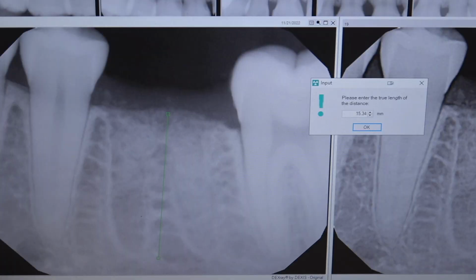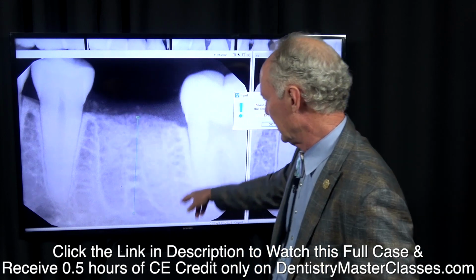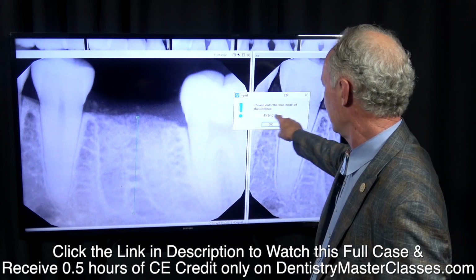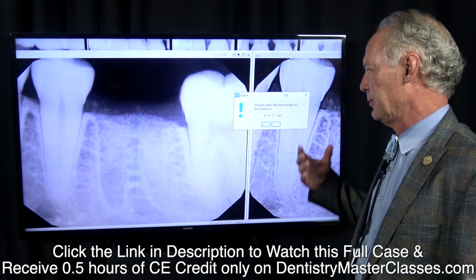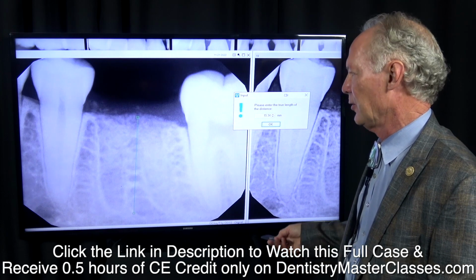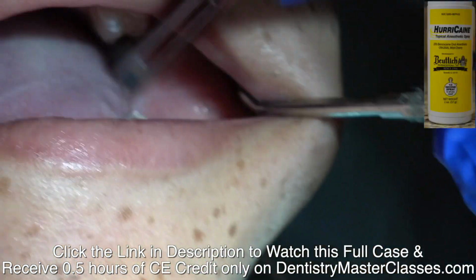So this is after 8 months of healing. It normally takes that bone about 6 months to heal, but you'll be able to see the outline of the roots even longer than that. So I know I've got 15 millimeters to the apex of the roots. So I'm going to place an implant that's 12 or 14 millimeters. 12 is plenty. This technique you can use without a cone beam.